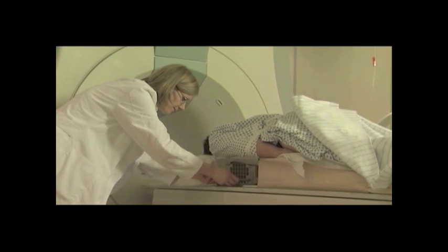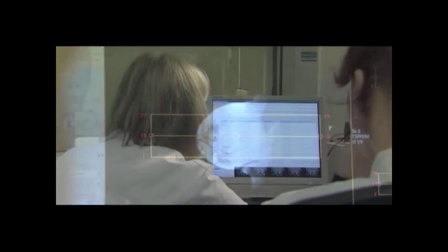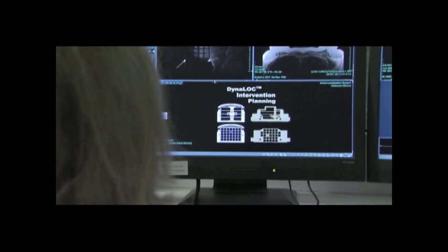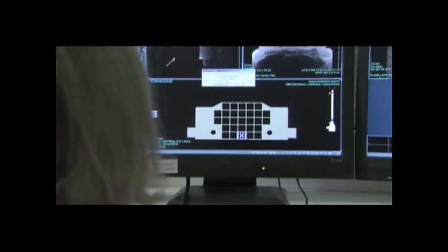Without visibility of the plate over the area of interest, the lesion cannot be targeted. After a full sequence of images is completed, the images are transferred to the interventional targeting software. Within the software, select the grid approach with the Atec biopsy device.